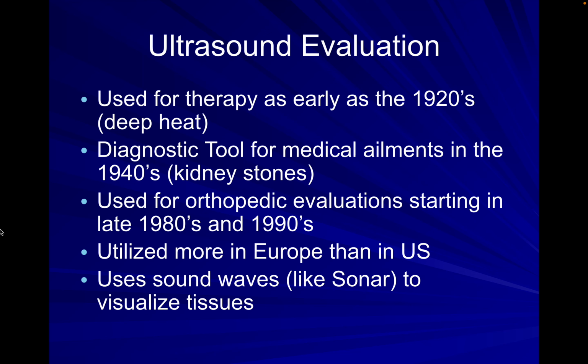And it's essentially taking electric current from a wall power source and vibrating a small crystal in the ultrasound to create what's known as a piezoelectric current. And that makes sound waves.